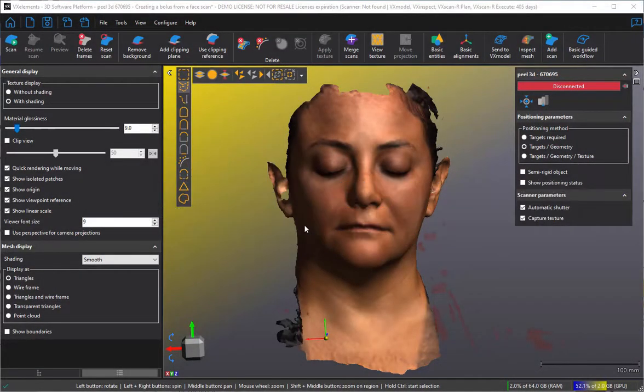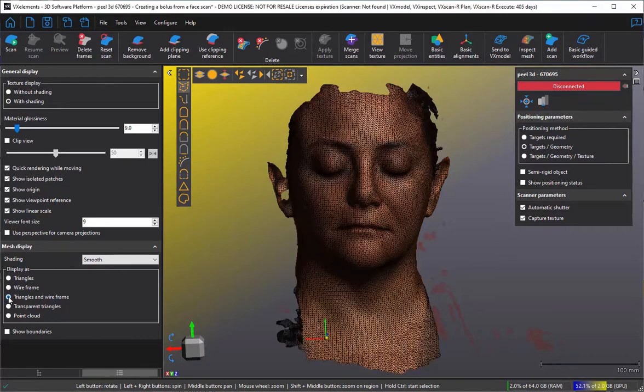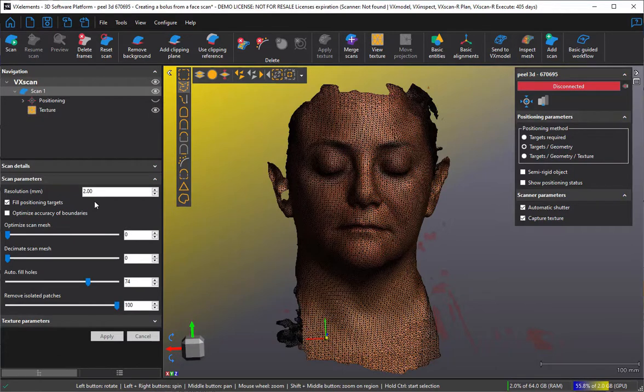Today I'm going to show you how to make a bolus for oncology purposes, and we'll take a really complicated one — we'll do a face. Here's a scan I acquired with our peel 2 scanner. It took about 20 seconds. I'm going to turn on the triangles to show you their size, because I scanned it at two millimeters. I could have scanned it at less, but it's probably enough for a bolus.